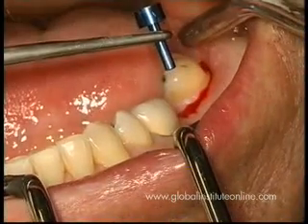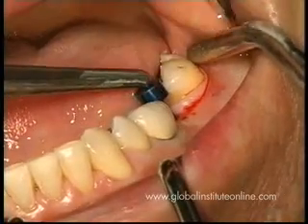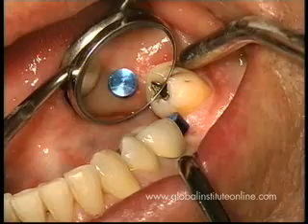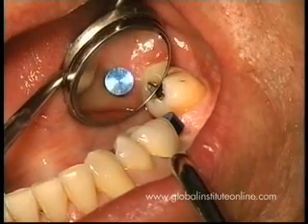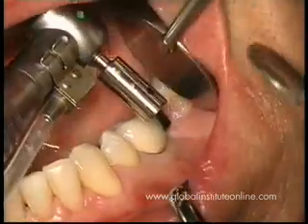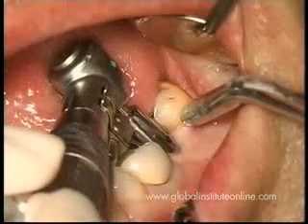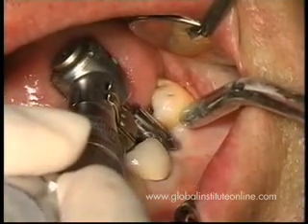The surgical parallel pin, which is going to be guiding the punch, will now be inserted, and it will fit exactly in this 2 millimeter drill. It will also demonstrate that we're staying within the keratinized gingiva, so not jeopardizing the keratinization. The next drill is the guided punch drill, which will only excise the gingiva.